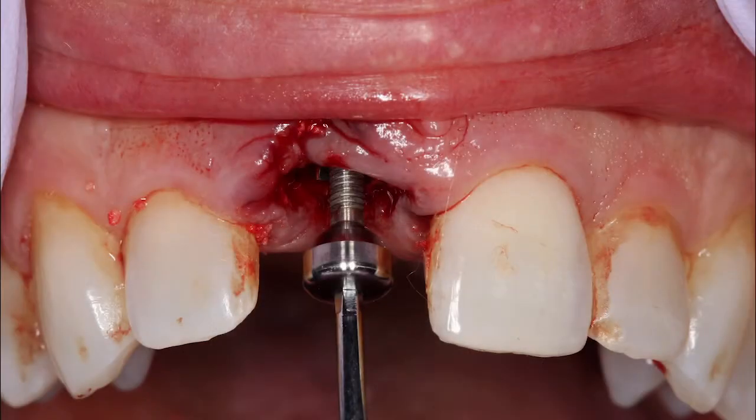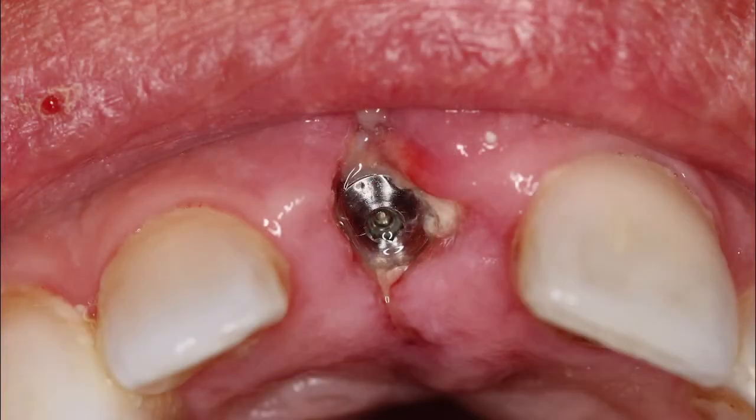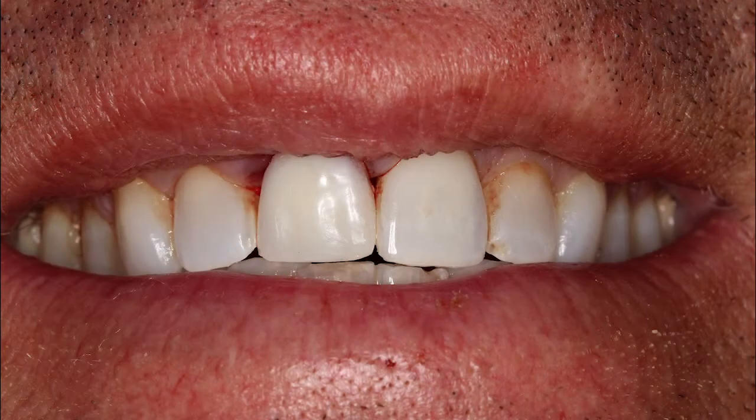Figure 9 shows that because the implant was optimally placed at the crest of the ridge, a 3 millimeter tall healing abutment was initially placed into the implant and torqued to 25 Newton centimeters. A removable transitional appliance was immediately seated for aesthetics, as shown in Figure 10.